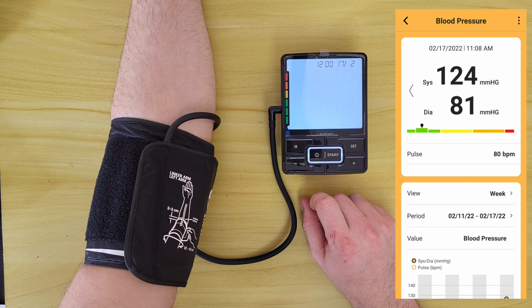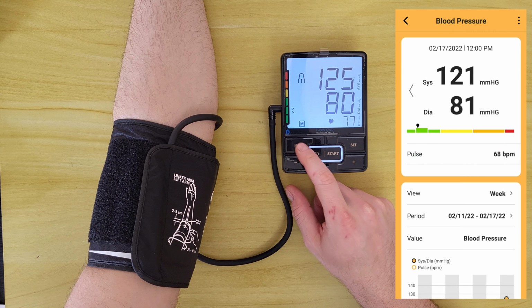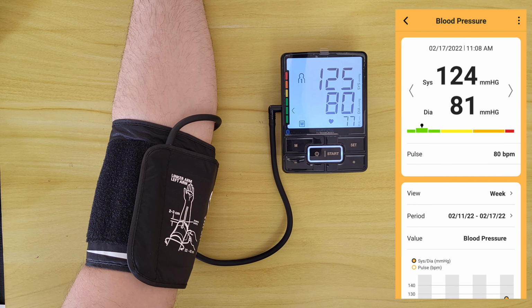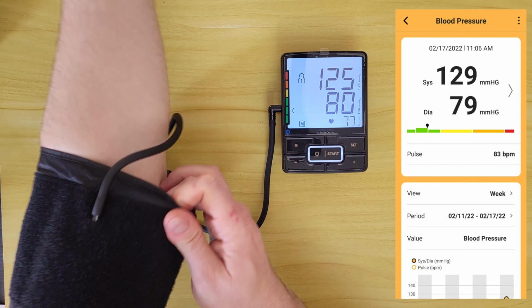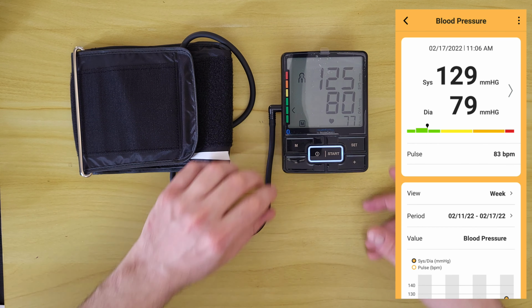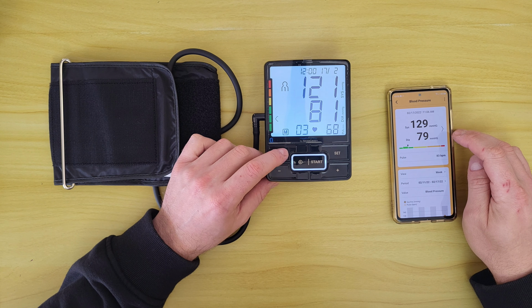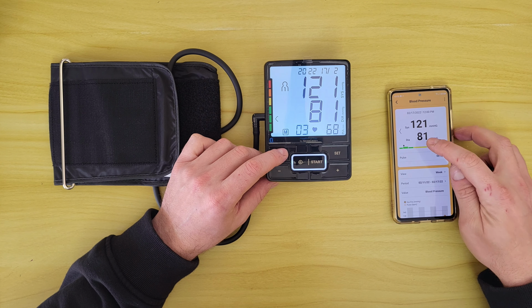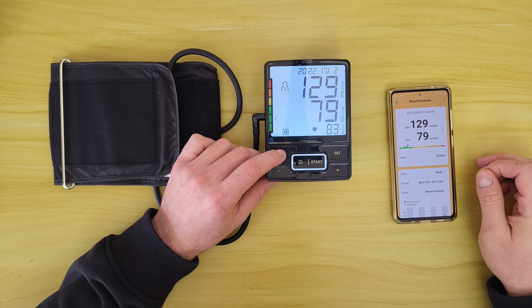Turn off, turn on again. And we can see Bluetooth is on by pressing the M button and synchronizing with my smartphone. And there I can see my third value on my smartphone, the systolic, diastolic, and the heart pulse. Easy way to measure your blood pressure, your systolic, diastolic, pulse, and everything. And compare it with my smartphone, just to check, we get the same values. Perfect.